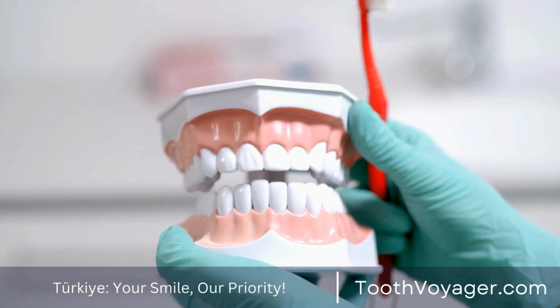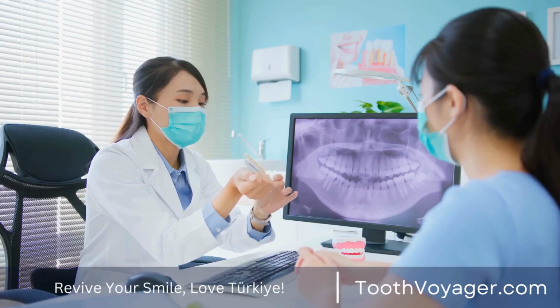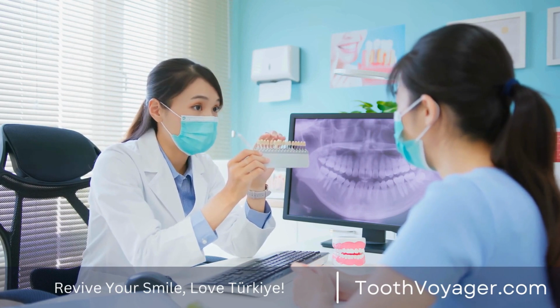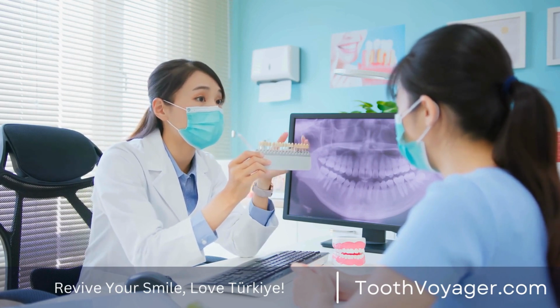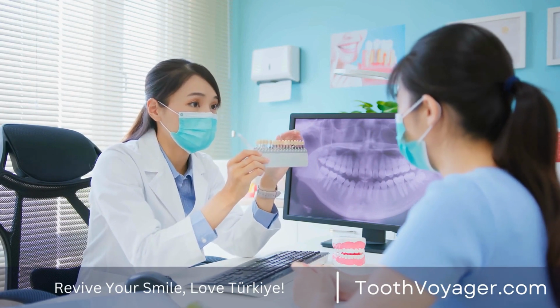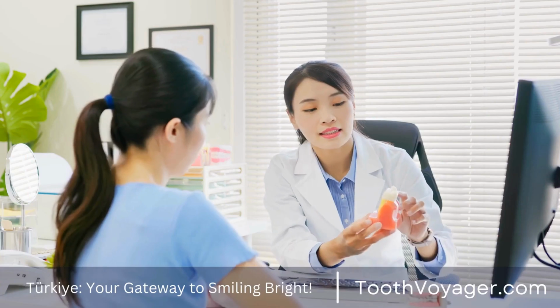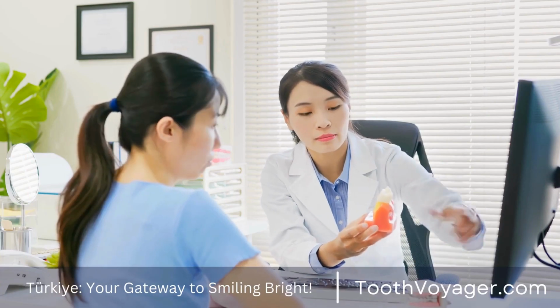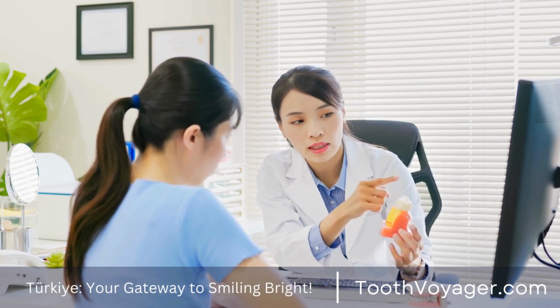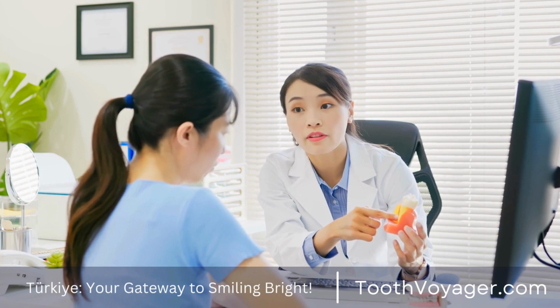Dental crowns, why do they exist? Dental crowns are utilized for many reasons. For example, the rehabilitation of teeth that are decayed or damaged, the improvement in appearance of the teeth, and to support dental bridges. Crowns for dental use are an incredibly versatile and reliable procedure option, which helps to improve the functionality, health, and appearance of your teeth.